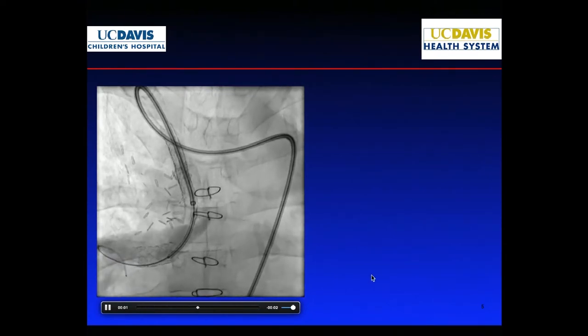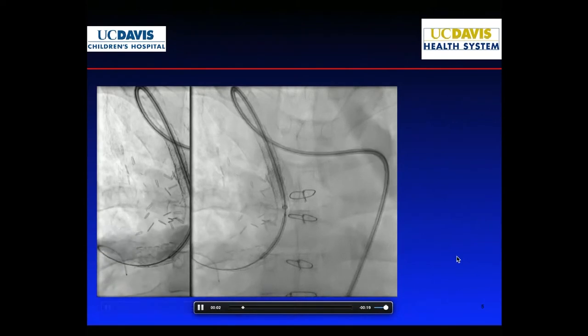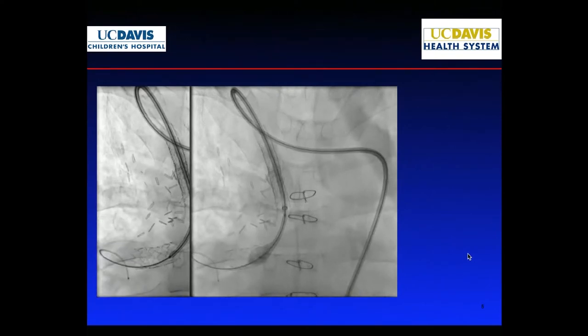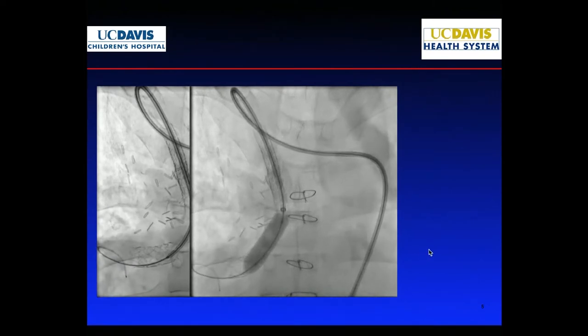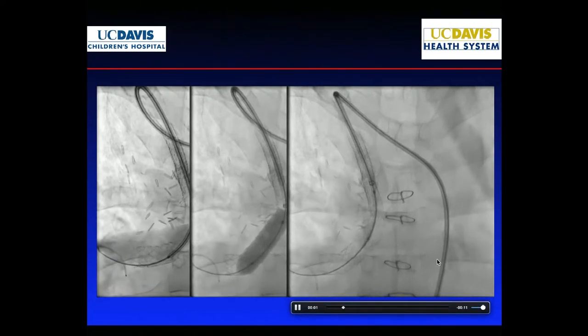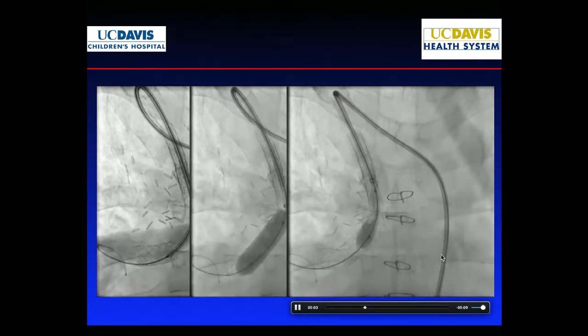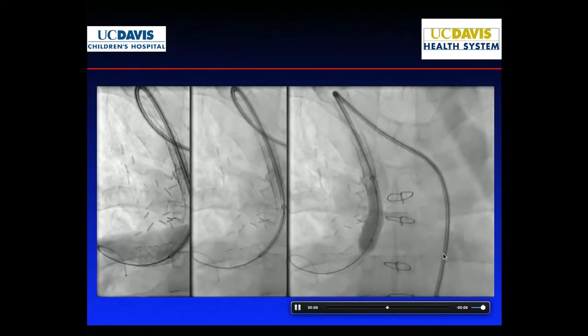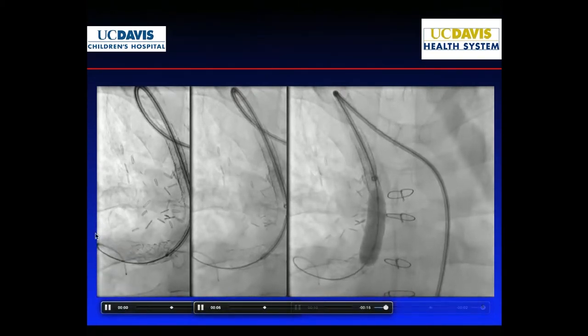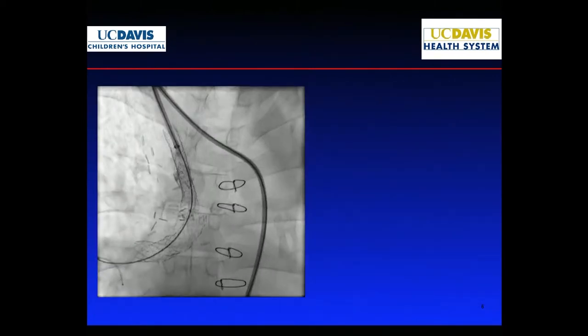So we took a picture and we implanted this second stent. This time we're slowly inflating so that if it jumps, we can bring it back, but you see that we're able to get it this time, right? So now we implanted two stents in telescopic fashion, and we finished with a little further dilation in this spot. So that's what it looks like. In some sense, I was pretty happy with this at this time, and this is the picture. So not perfect, but better.